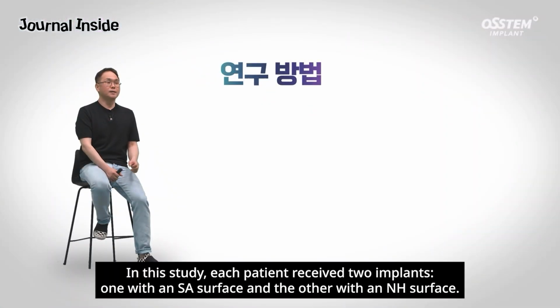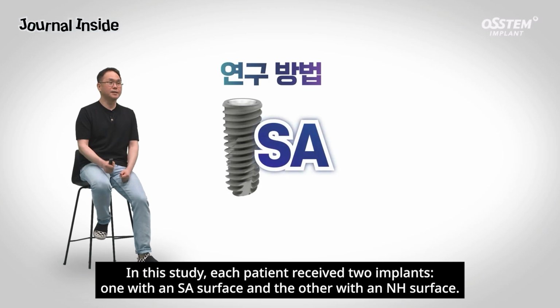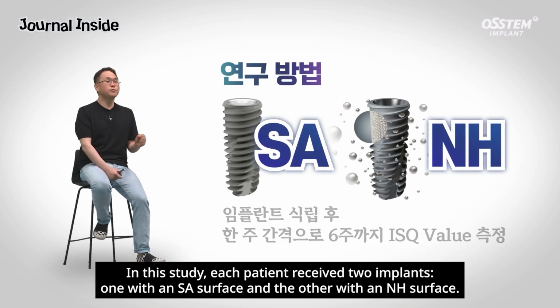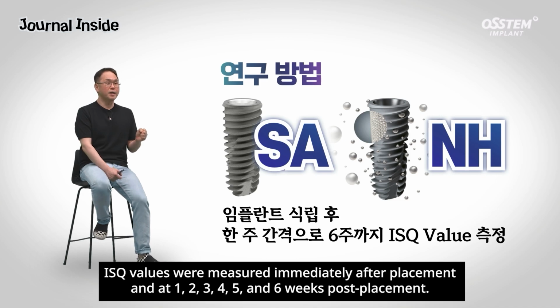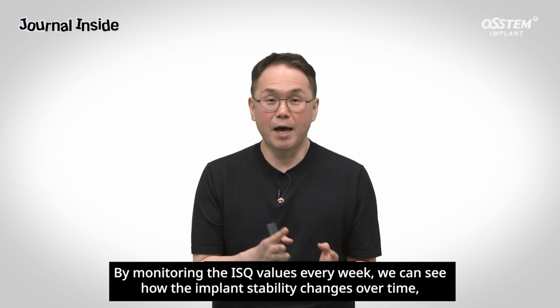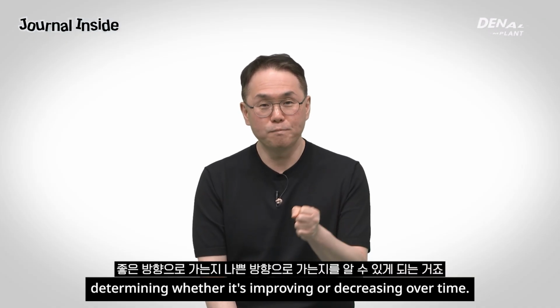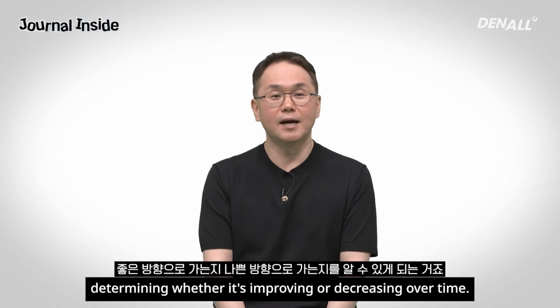In this study, each patient received 2 implants, one with an SA surface and the other with an NH surface. ISQ values were measured immediately after placement and at 1, 2, 3, 4, 5, and 6 weeks post-placement. By monitoring the ISQ values every week, we can see how the implant stability changes over time, determining whether it's improving or decreasing over time.